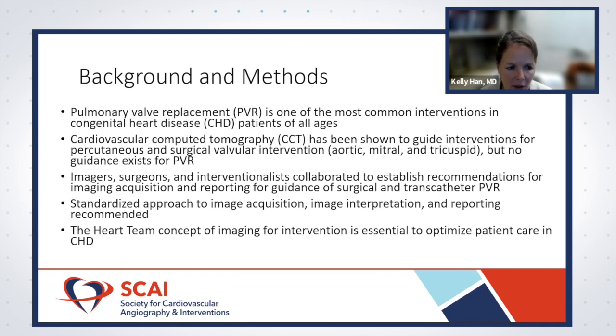And so we got together a group of imagers, surgeons, and interventionalists that included pediatric and adult cardiology and radiology. And we really wanted to talk about what information we can give to both surgeons and interventionalists to help them plan their transcatheter or surgical valve replacements. We wanted a standardized approach to image acquisition, image interpretation, and also reporting. And I think it's an example of the importance of what we can learn from each other using the heart team concept.